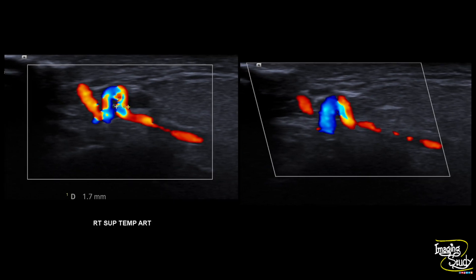Here is the largest diameter of the lumen, where you can see the diameter is around 1.7 mm. This is the narrow part. You can see the hypoechoic wall thickening quite well here.